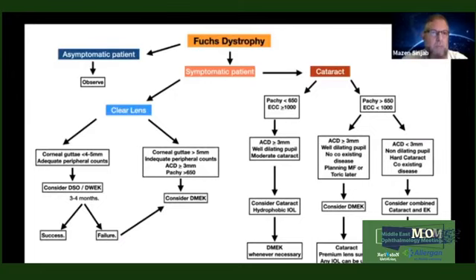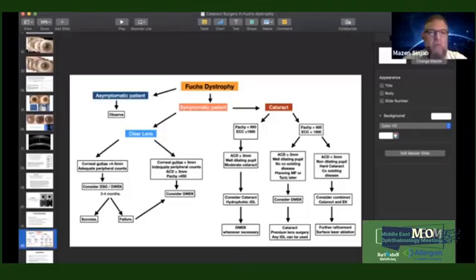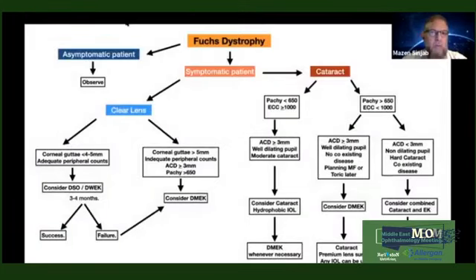So it is recommended for the IOL to be overcorrected, or to target about myopia of 1 to 1.5 diopters, because when the thickness regresses, then the K reading, or the curvature of the cornea, will go down.